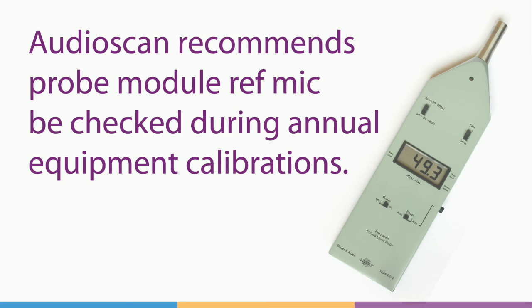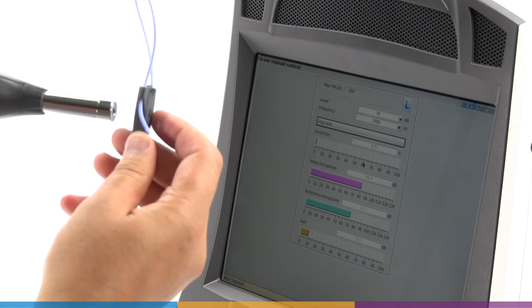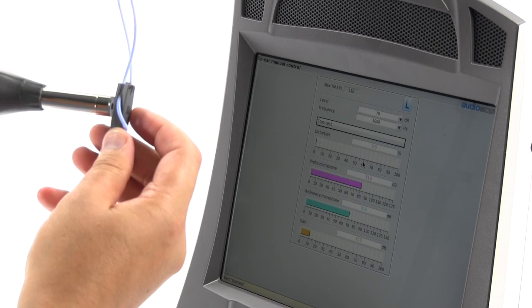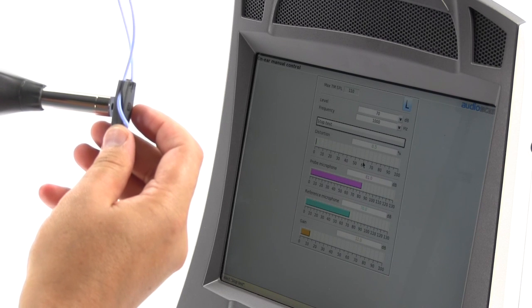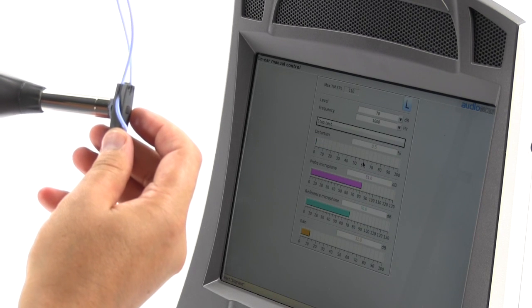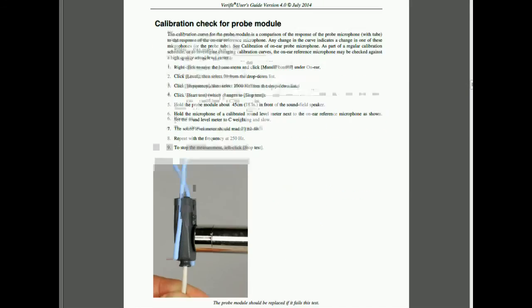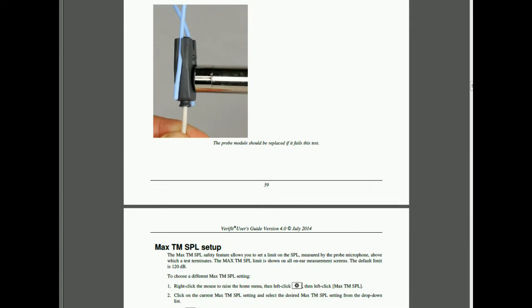While the user calibration may be performed weekly, AudioScan recommends an annual calibration check of the probe module reference microphone level. It is often convenient to have this done when other equipment is being calibrated. The technician will check the reference microphone against a calibrated sound level meter to ensure it has not drifted from factory calibration. Further details on this annual procedure are available in the user guide or the system help menu.